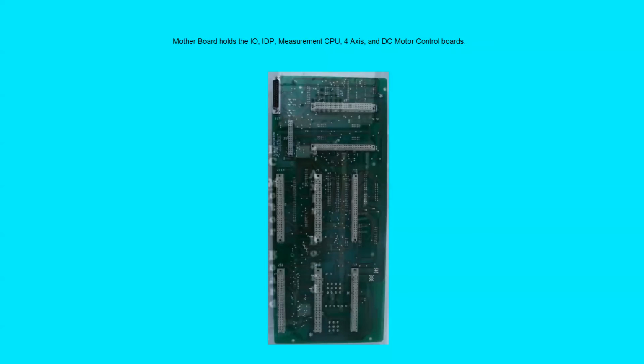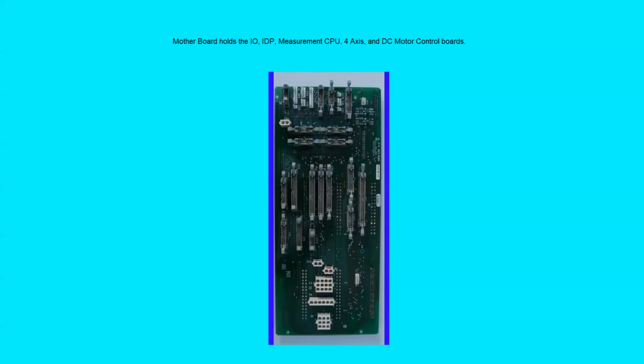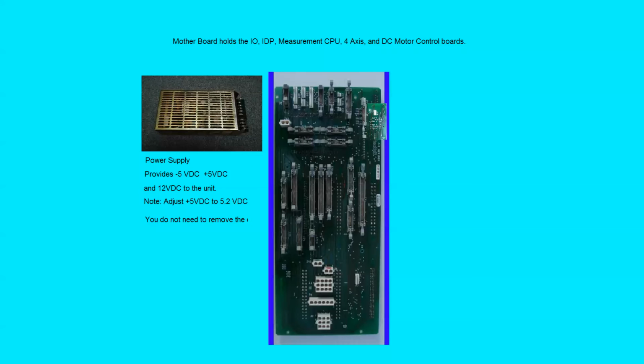This is a training film on the STA Compact, manufactured by Diagnostica Stago. We are first going to start off with a little description of what we're going to refer to as the motherboard, which houses many of these circuit boards.